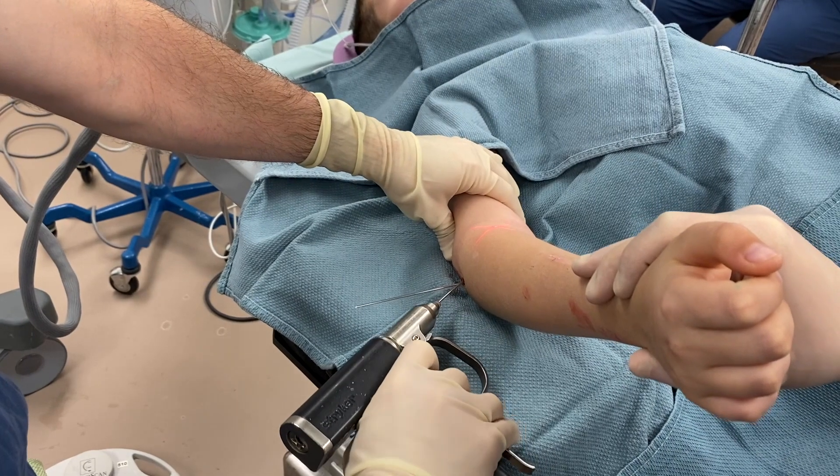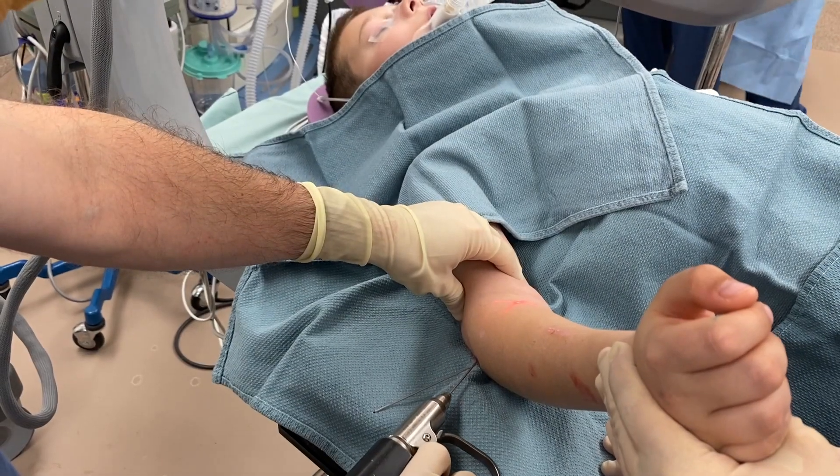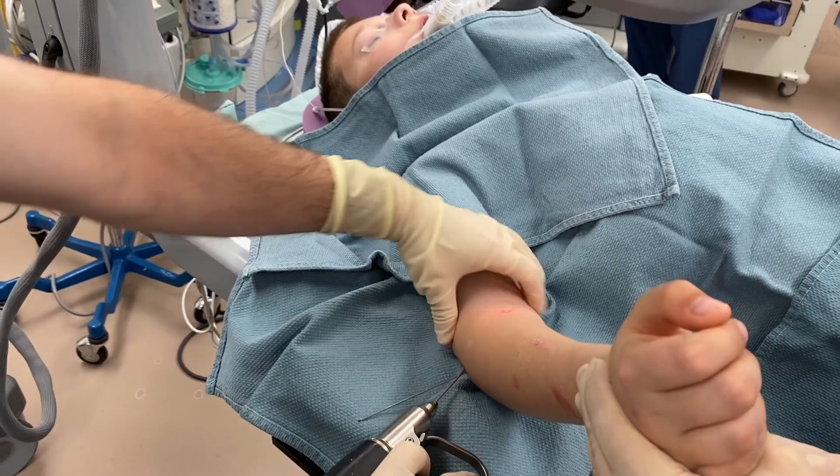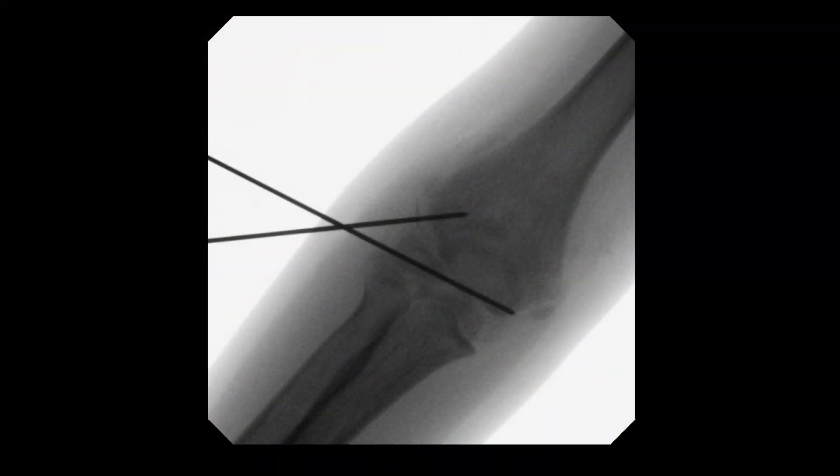A second percutaneous wire is then driven up the lateral column. Again, multiple fluoroscopic views are obtained as the pin is advanced.